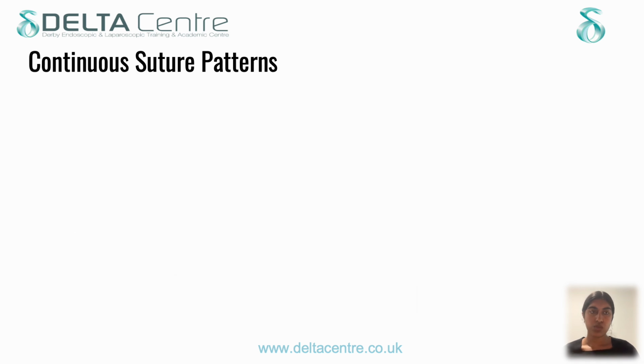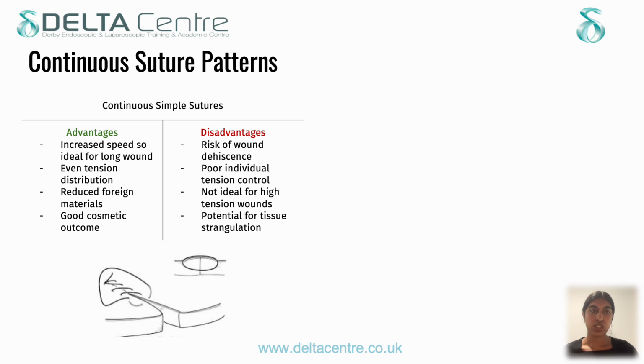And next we'll talk about the advantages of continuous simple sutures. Advantages of this include increased speed. It's much faster to place than interrupted sutures, making it ideal for longer wounds.